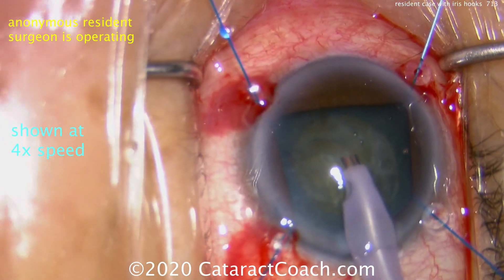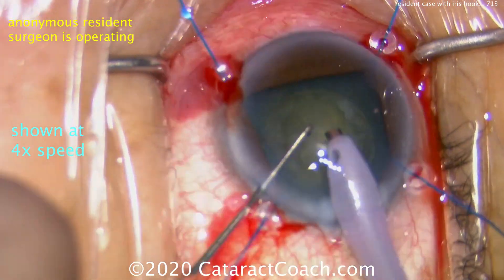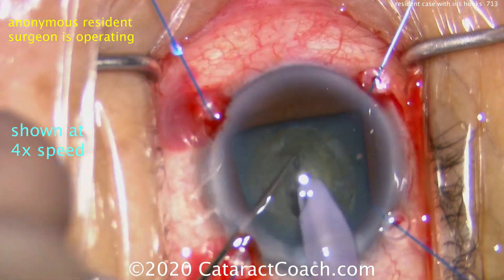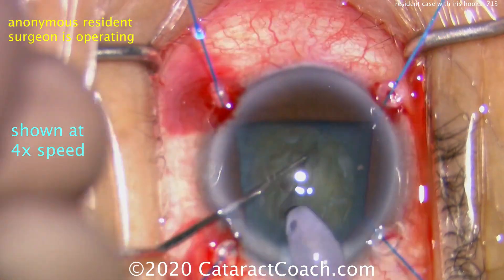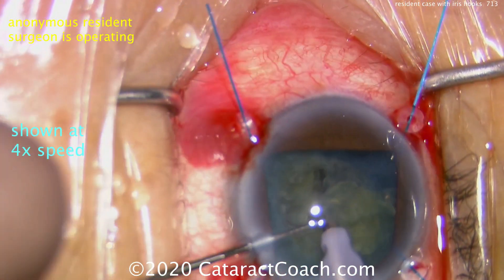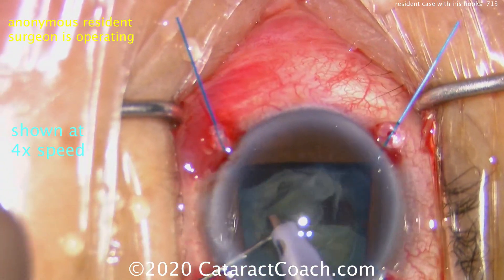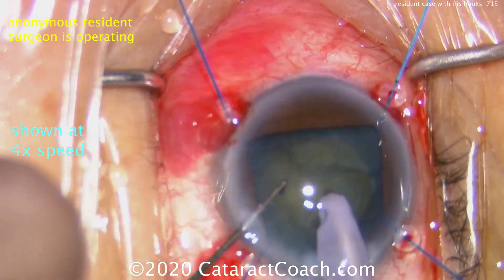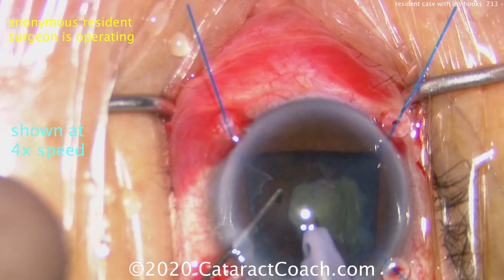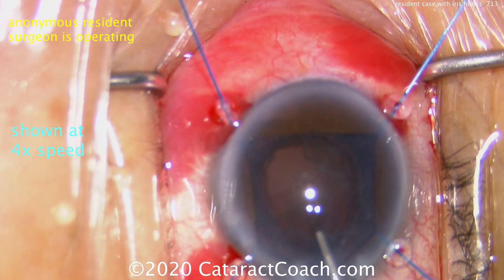There's the lens — nice, good density. The phaco probe is going in, with the second instrument cleaning things up. It looks like a good groove right down the middle — very reasonable technique. Get a nice central groove and this nucleus can then be split into two halves, with each half sub-chopped into smaller pieces and brought up towards the iris plane. We're watching this video sped up at four times normal speed, to show the whole video and all the little nuances.